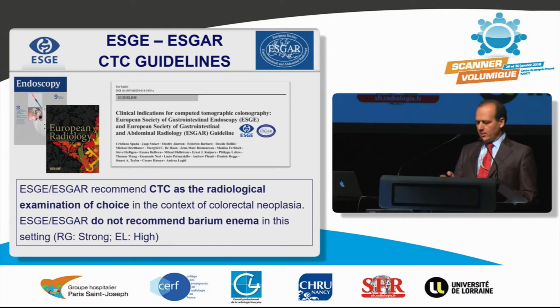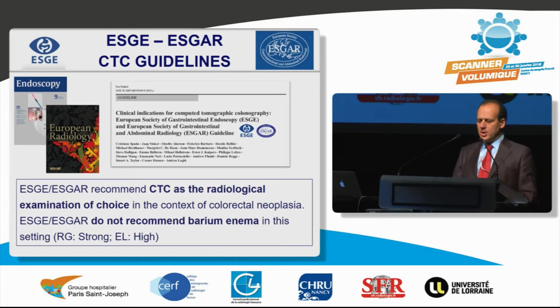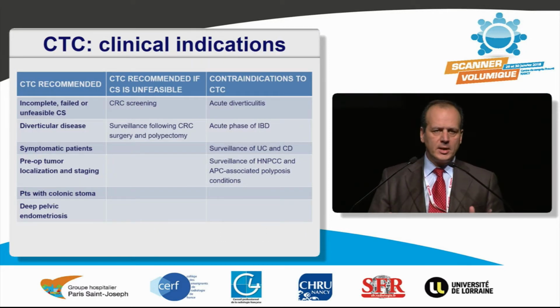And both societies, of course, recognize CTC as the radiological examination of choice in the context of colorectal neoplasia, and both societies discourage the use of barium enema. That's, I think, the most important goal. Then we can go through the different indications.